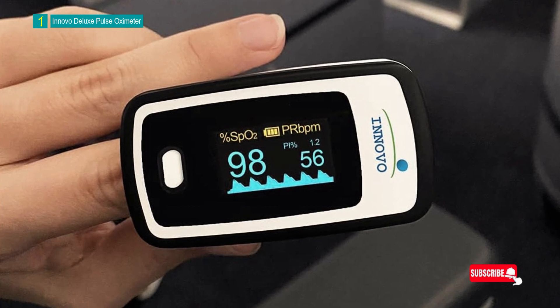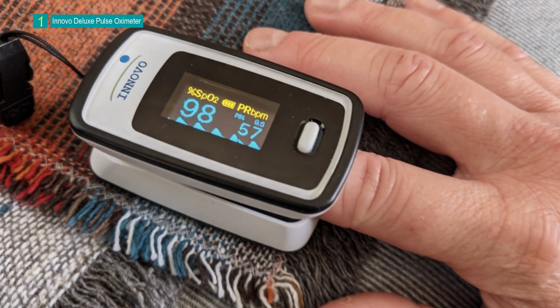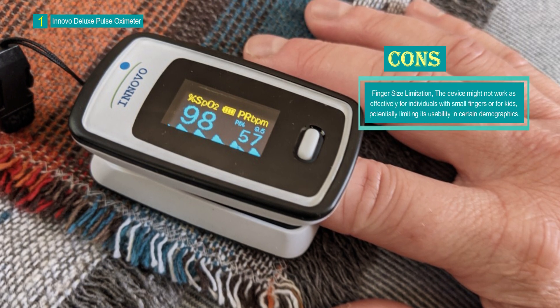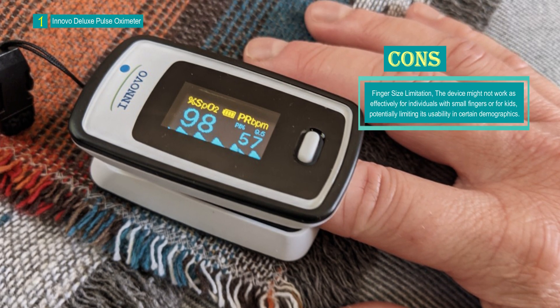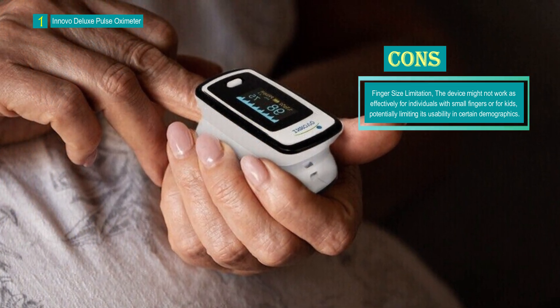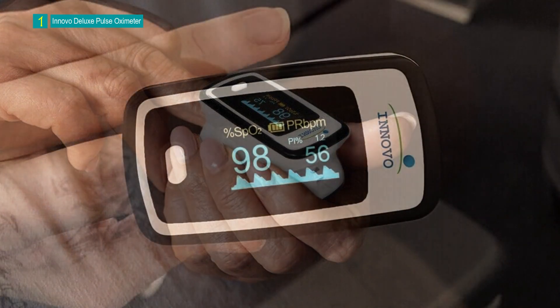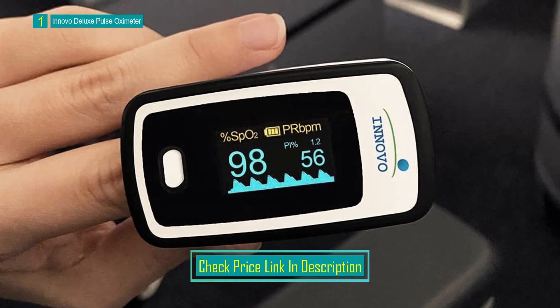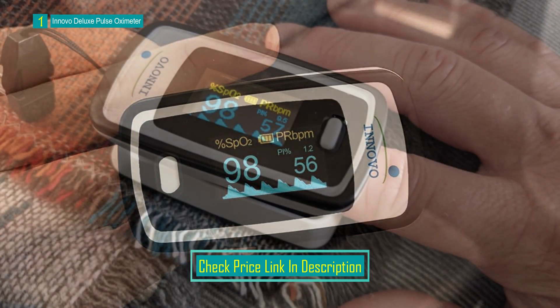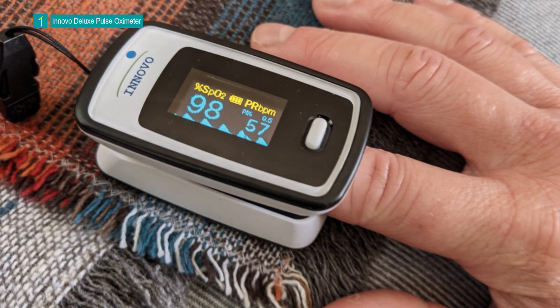The Innovo Deluxe IP900AP Fingertip Pulse Oximeter stands out as an advanced and accurate health monitoring device. With its plethysmograph and perfusion index features, multi-directional display, auditory alarm, and portable design, it provides users with reliable insights into their pulse and blood oxygen saturation. Despite limitations related to finger size and battery dependence, its innovative features, accuracy, and user-friendliness make it a valuable tool for health-conscious individuals — whether athletes, aviation professionals, or those seeking to monitor their health.